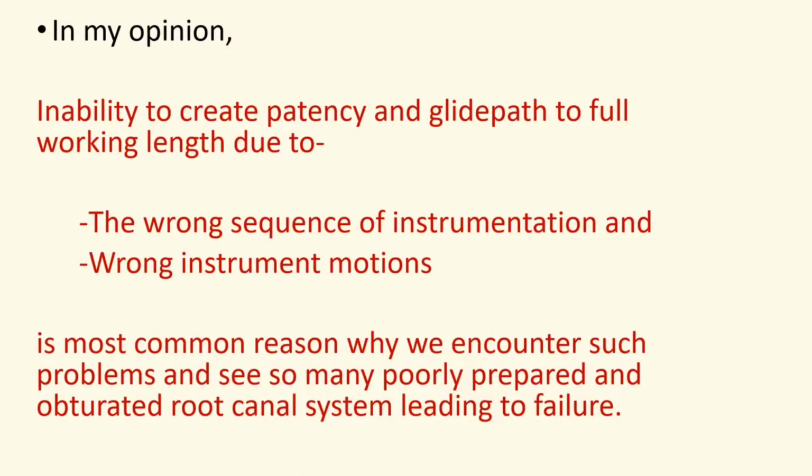In my opinion, inability to create a patency and glide path to full working length due to the wrong sequence of instrumentation and wrong instrument motions is the most common reason why we encounter such problems and see so many poorly prepared and obturated root canal systems leading to failure. Friends, in this presentation, I will try to simplify the steps in the glide path preparation, proper sequence of instrumentation, and step-by-step technique of glide path preparation within my limits of knowledge and experience.